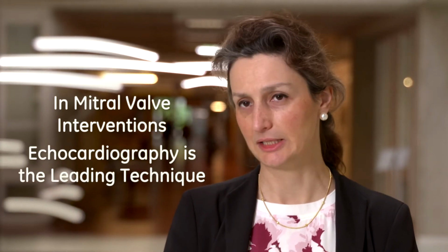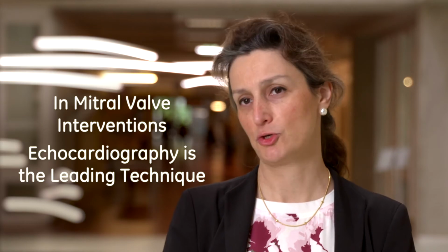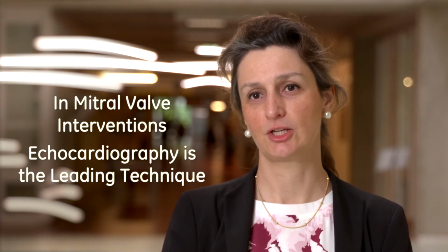Instead, for the mitral valve interventions, echocardiography is the leading technique, because fluoroscopy doesn't have enough spatial resolution to show the soft tissue. So although the interventionalist is going to use fluoroscopy, particularly for the transseptal puncture, for example, or for orientation, echocardiography is the imaging modality that they use more frequently.